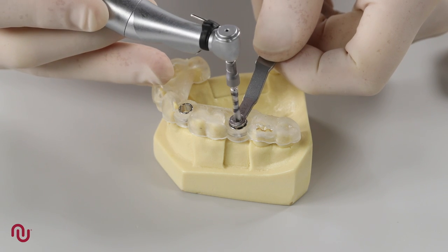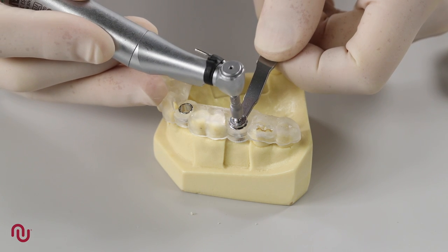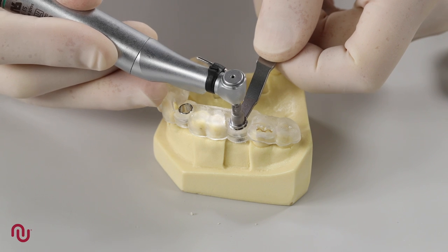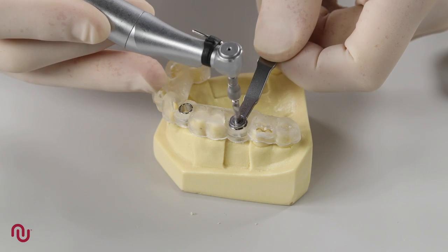We then drill to hub and then remove the guide key. This process is continued for all drills according to their recommended Neos drilling protocol.